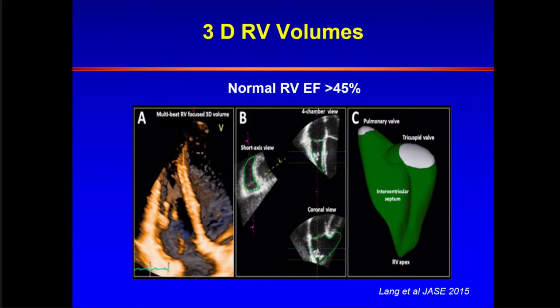Also, it is recognized that as individuals get older, these volumes decrease and ejection fraction increases. On average, end diastolic volume decreases by 5 milliliters per decade, whereas end systolic volume decreases by 3 milliliters per decade, with an ejection fraction increasing by about 1% per decade. The lower limit of normal is 45%.